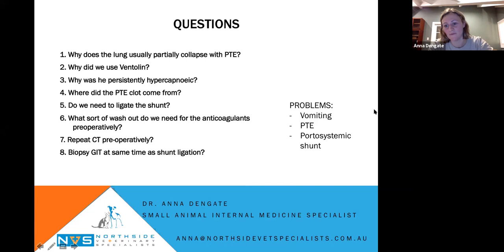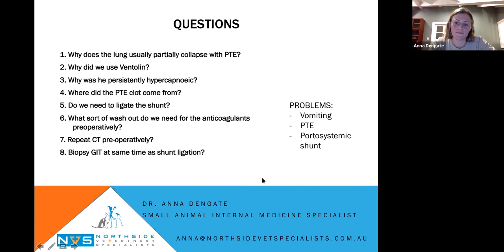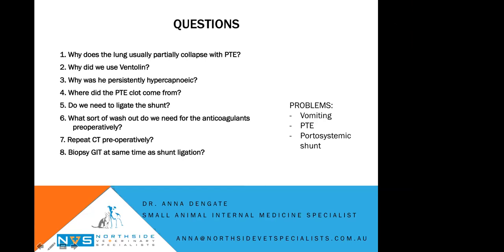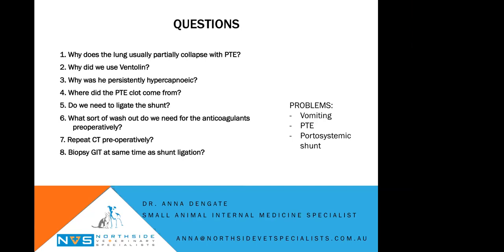You go, Liz. I was just going to ask, is there any way you could prove that there's stasis in terms of the blood flow in that vessel? Are there any diagnostic tests? Like color flow Doppler. We could do, but I'm not sure how accurate the measurements are, like whether we'd detect decreased velocity in a shunt relative to the portal vasculature. But you might see a clot in the shunt. You might see sluggish flow, agglutination of platelets. There might be an anatomical substrate you can see with color flow Doppler.